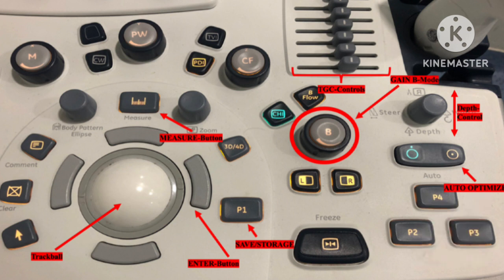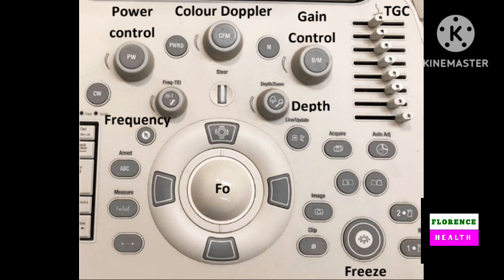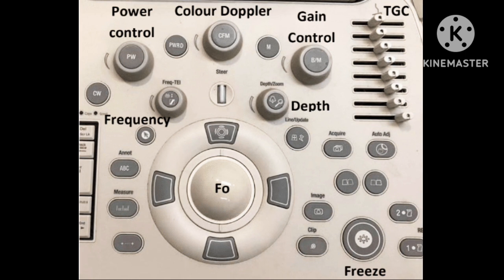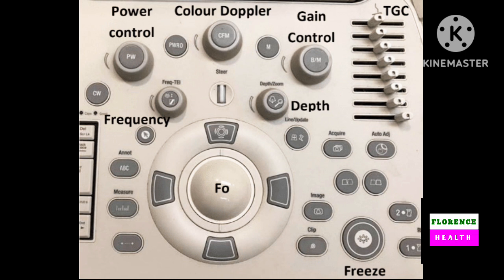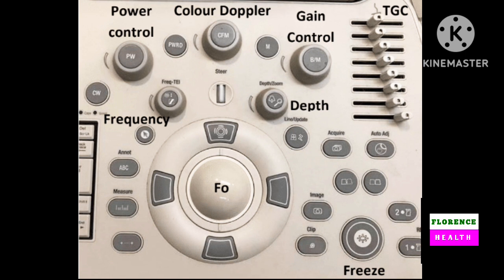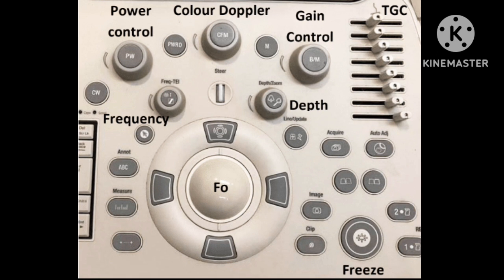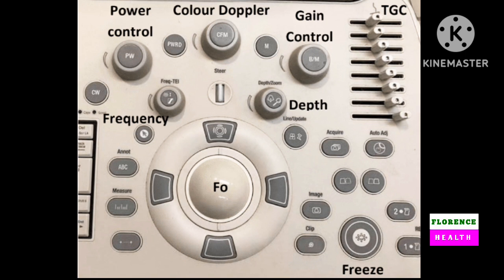Ultrasound machine has two parts. One is the screen or monitor, another is the control panel. Control panel has a keyboard and different types of knobs. There are three types of knobs present in every ultrasound machine. One is the rotating knob, which comes into function by rotation of the knob. Second is the sliding knob, which comes into function by sliding the knob. And third is the pressing knob, which comes into function by pressing the knob.